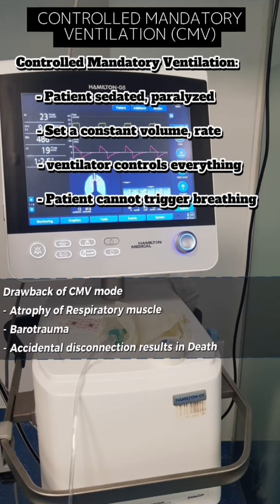Now let's talk about the drawbacks of CMV mode. Since we have paralyzed and sedated the patient, there is no breathing effort, and if the patient is prolonged ventilated and has a prolonged ICU stay, there is atrophy of respiratory muscles. And if we set the constant volume, sometimes to give the certain amount of volume, the ventilator has to apply more pressure, which results in damage of the alveoli and bursting of the alveoli, leading to barotrauma.